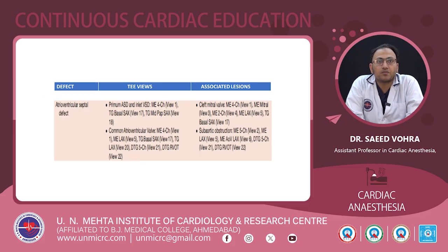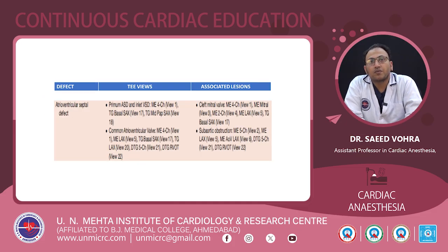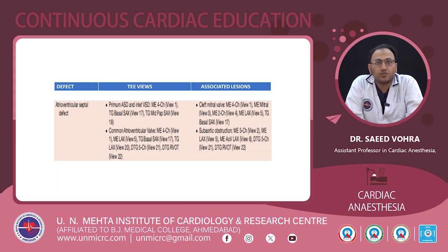In patients with atrioventricular septal defect, AVSD patients, there is an ostium primum ASD and an inlet VSD, which is best seen in the mid-esophageal four-chamber view, transgastric basal short axis view, and transgastric mid-papillary short axis view. The common atrioventricular valve present in AVSD patients is best seen in the mid-esophageal four-chamber view, mid-esophageal long axis view, transgastric basal short axis view, deep transgastric five-chamber view, and deep transgastric RVOT view. There can be a cleft in the mitral valve, which is seen in the mid-esophageal four-chamber view, mid-esophageal mitral two-chamber view and long axis view.